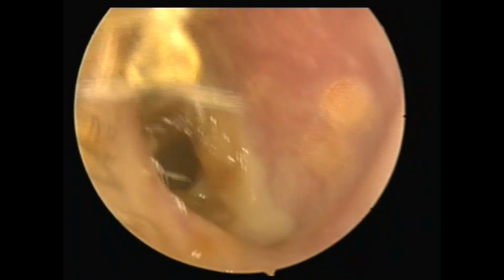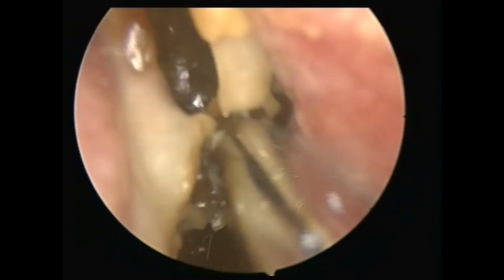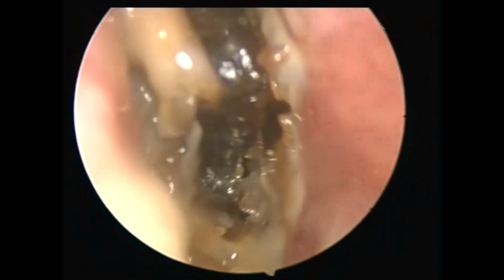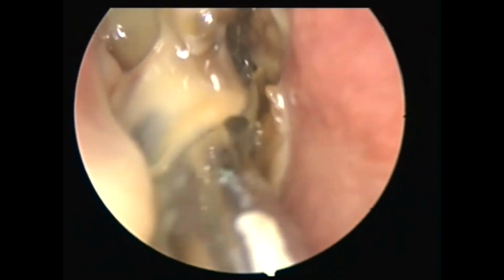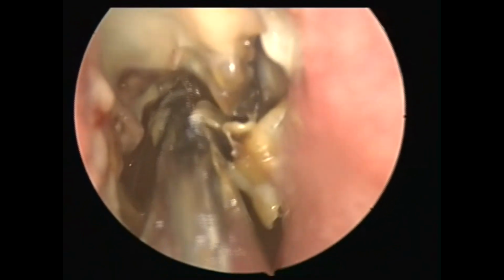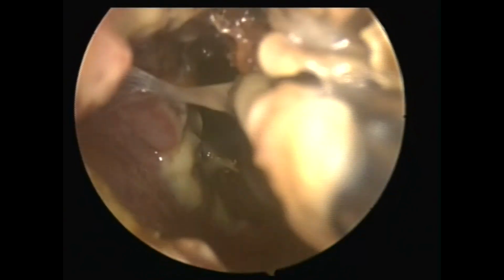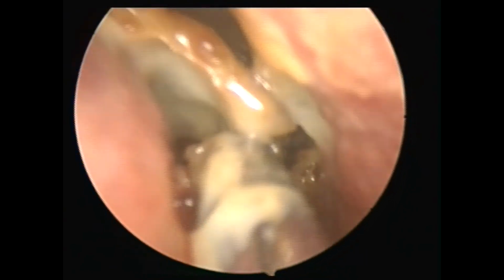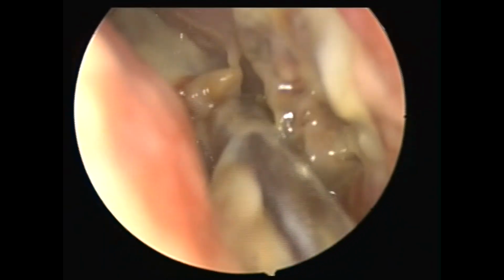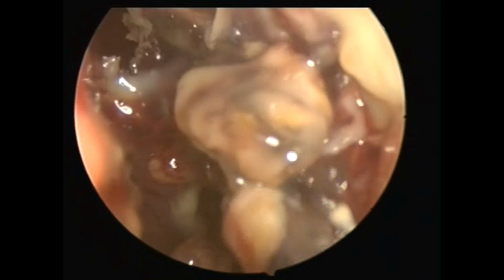This is a day 15 post-op video, routine nasal endoscopy of the patient. This was a patient of AFRS, allergic fungal sinusitis. As you can see, I'm on the patient's right side, using my suction in the right side nasal cavity, trying to move the secretions, cheesy pus secretion, and a lot of nasal scab formation which had collected in the anterior naris area.